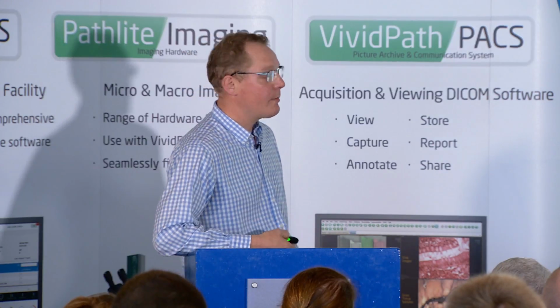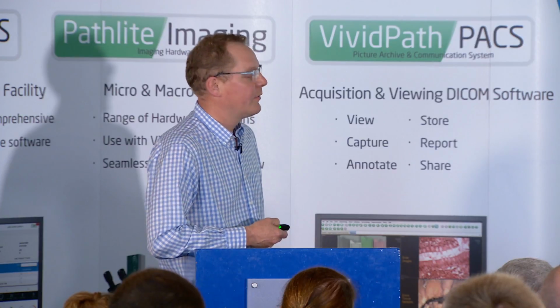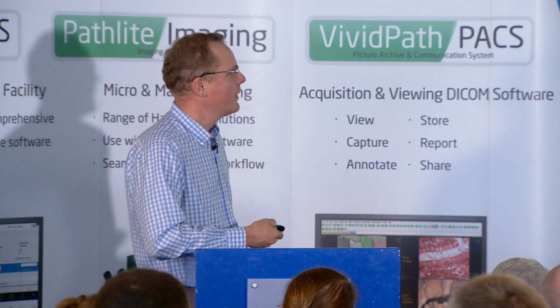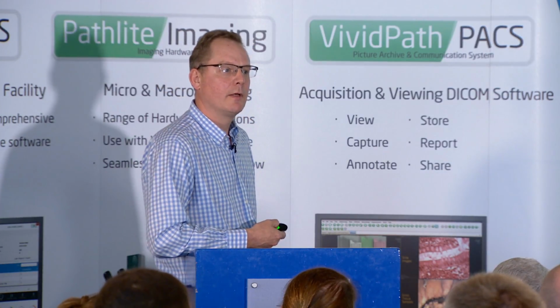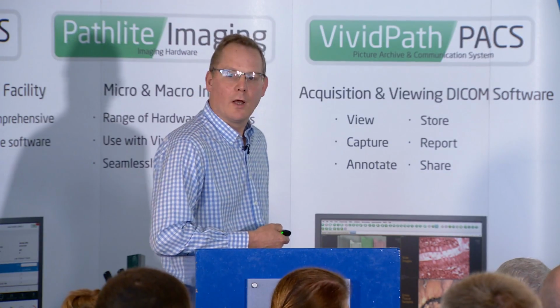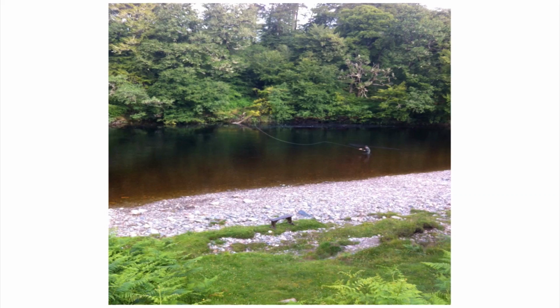If you're talking about biomarker analysis, then you're talking about stuff which is downstream of the diagnosis. So the pathologist has made a diagnosis of cancer and he wants to know, is it estrogen receptor positive? Those slides have to be cut and stained and then analysed downstream of the pathologist. So these algorithms may not be on the workstation, they may be on the cloud, providing you can manufacture a way that the computer knows where the cancer is and what it's got to look at to do the analysis. Or it may be on the workstation and the pathologist looks at it again and uses it, which is a conventional way of doing it.